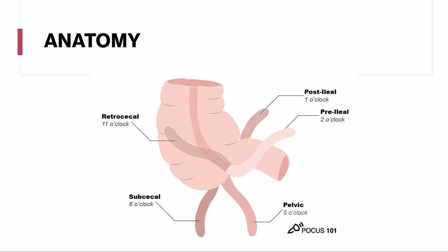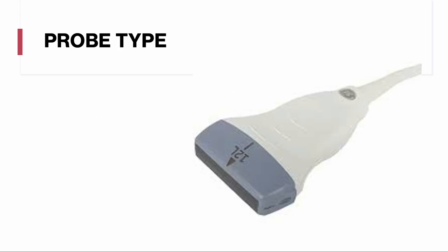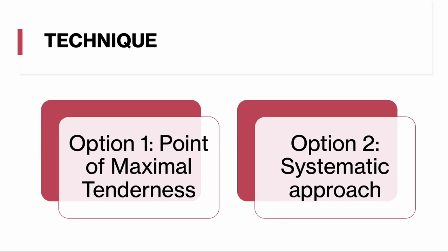The probe type will be the linear probe, but if imaging an older or adult patient, you may switch to the curvilinear for more depth. There are various techniques: one option is to have the patient point to the area of maximal tenderness and start scanning there. The other is a systematic approach — start in the right upper quadrant in transverse orientation with the indicator facing the patient's right, trace the ascending colon downward to the cecum, then move slightly medial and scan in a lawnmower pattern throughout the abdomen until you find the appendix. There's no right or wrong answer; use whatever you're most comfortable with.